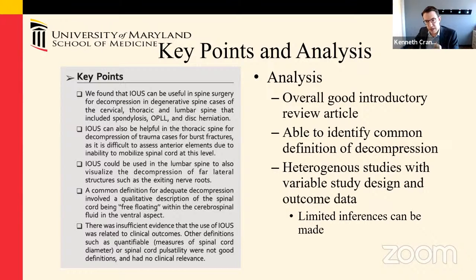But to also answer Jens's question with regards to anterior, as Josh said, the biggest issue is being able to fit the probe into where you're working, which you should probably be able to do in an anterior cervical approach. I don't think you would get much information from just a discectomy.